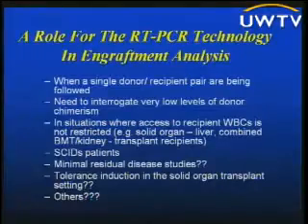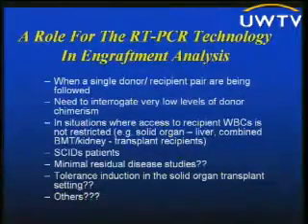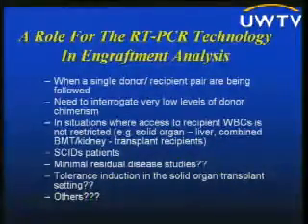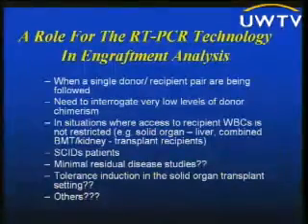So given all of this, is there a place for this new technology in engraftment analysis? I believe there is, but in very restricted settings. So here are a few things that I could come up with in terms of where we could use this assay. One is if you're only looking at a single donor recipient pair and you're not restricted in terms of how much DNA you had pre-transplant from the recipient or from the donor, and could just run this over and over again, you'd be fine.